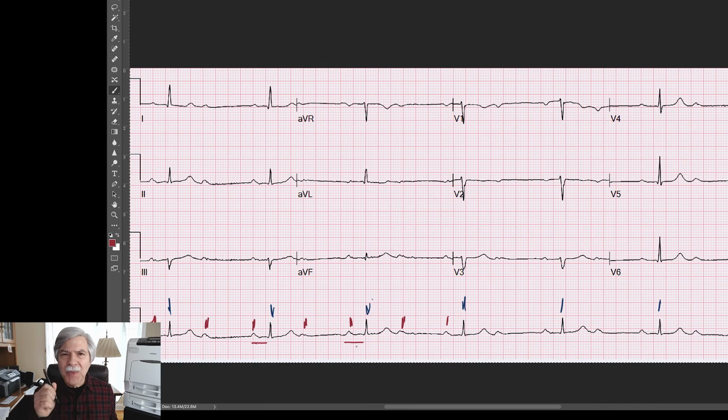When they do ECG Academy, people always ask me how they can put calipers on the screen to measure, because they're used to the courses in the hospital that said, measure the PR interval and you have to be exact. Well, the number isn't always as important as the idea.